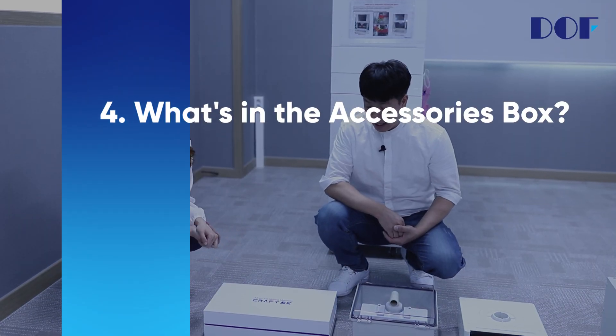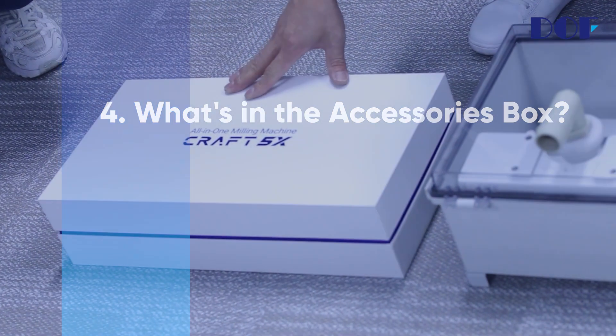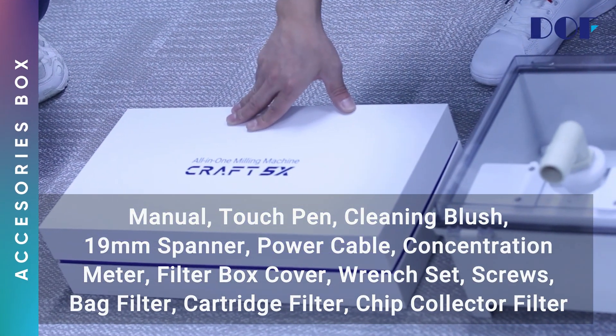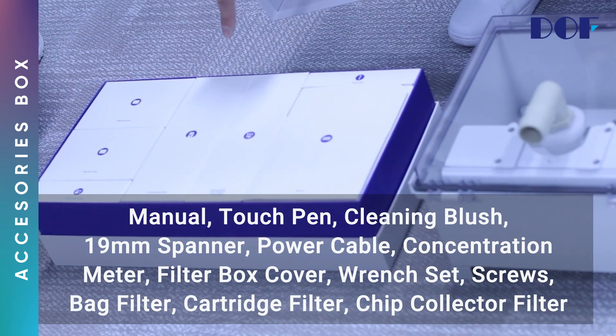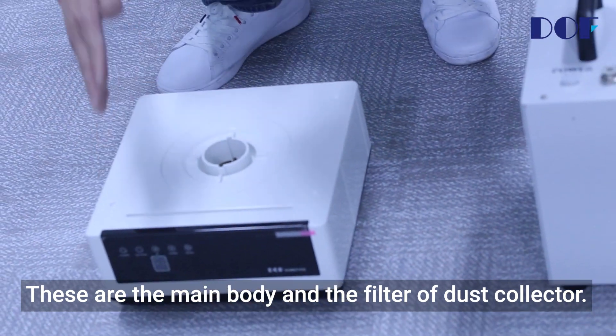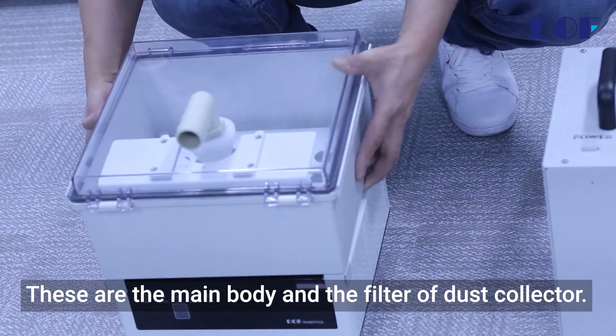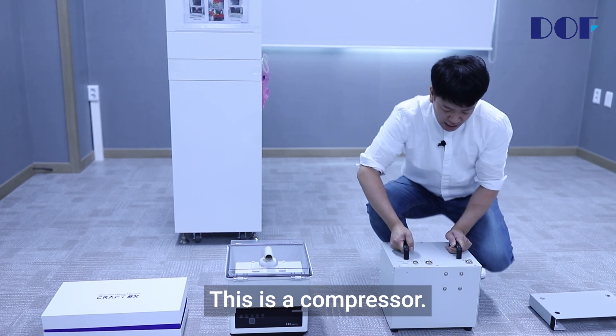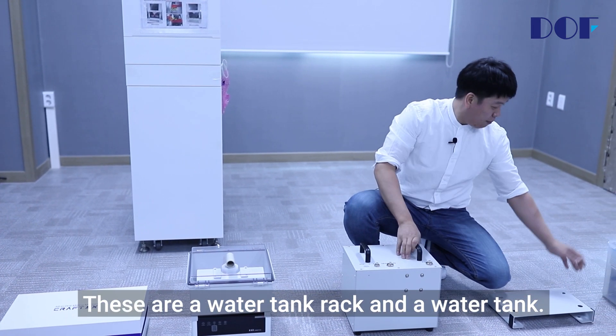What's in the accessories box? This is a small accessory box containing items that you need while using the machine. This is a dust collector — these are the main body and the filter of the dust collector. This is a compressor. These are a water tank rack and a water tank.